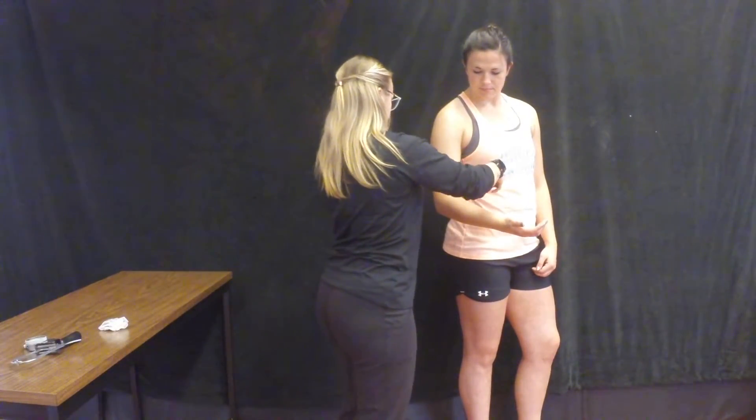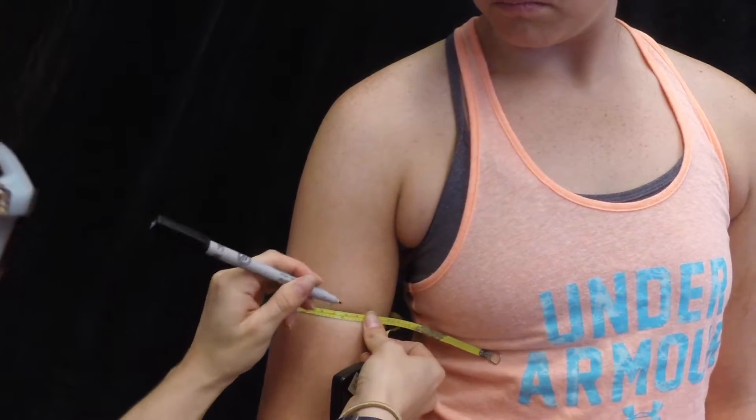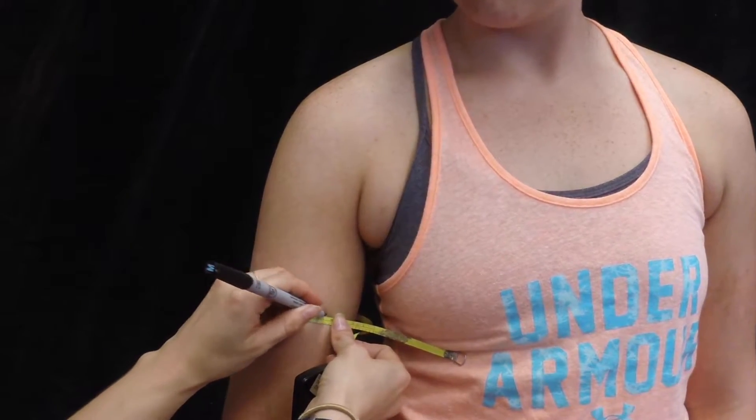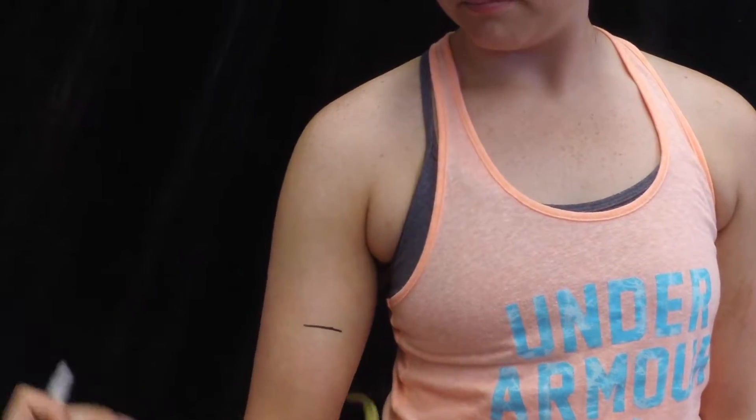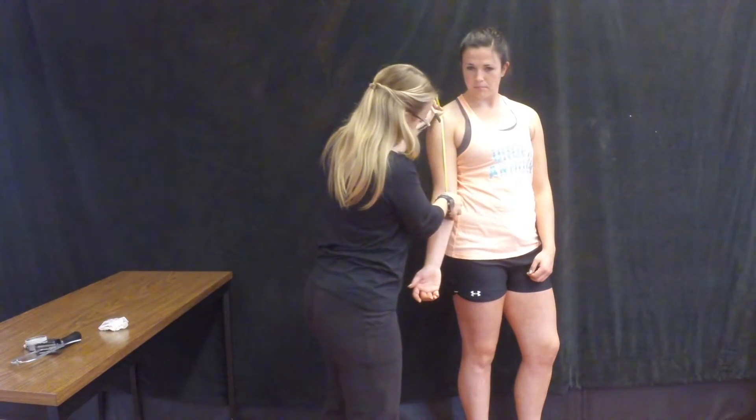Now wrap your tape measure around the arm horizontally, so you can transfer your mark to the front of the arm. Now make another mark which intersects this line along the midline of the front of the arm.